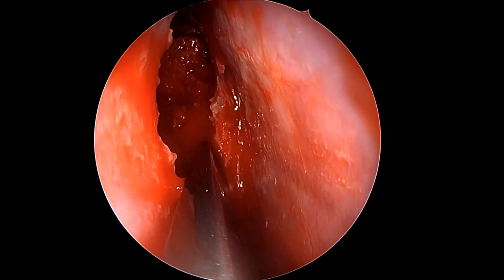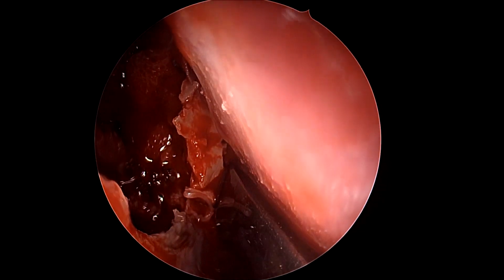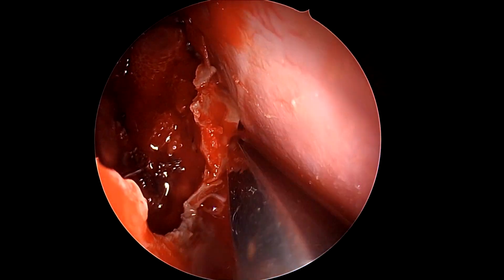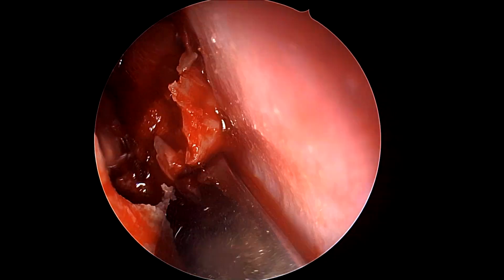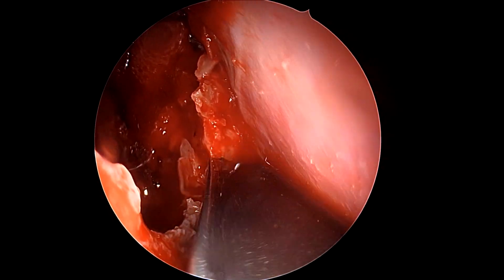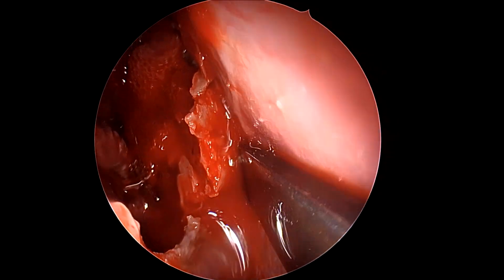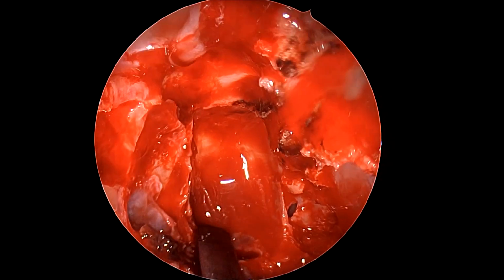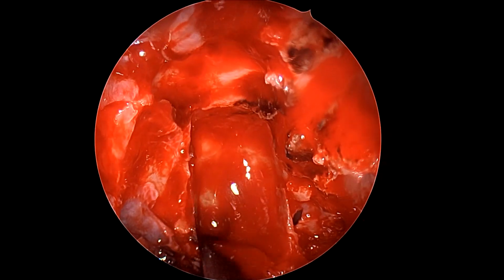One can use a drill for removing the rostrum or sphenoid. However, in the interest of time, we normally prefer to use a chisel and hammer. It's quite quick. There's nothing much to worry about here. We use some quick, controlled strokes of a chisel to at least subtotally get the rostrum out. And once we do so, the rest of the part can be done with a standard nasal skull-base drill.